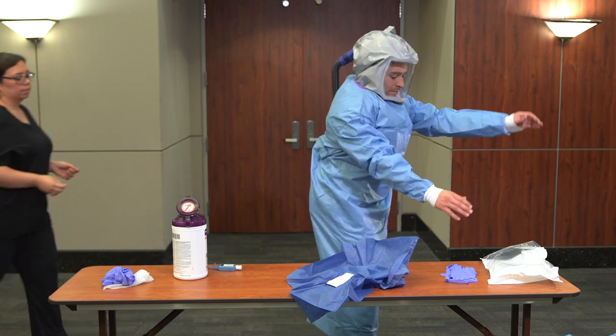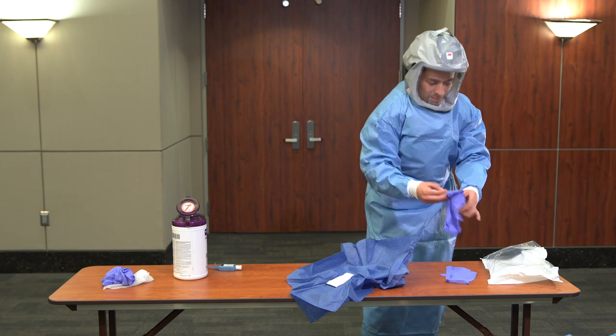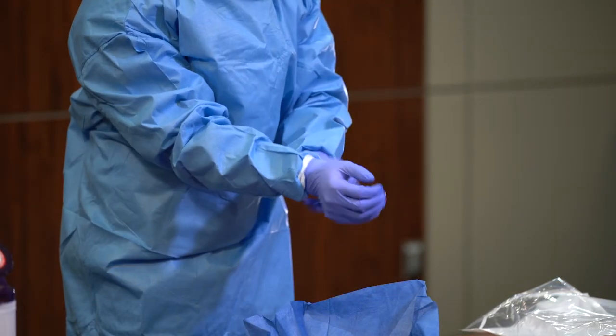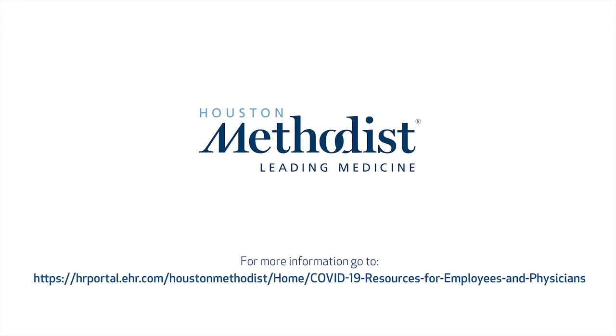Don gloves, ensuring that the cuff of the glove covers the cuff of the gown. You are now ready to care for the next patient.